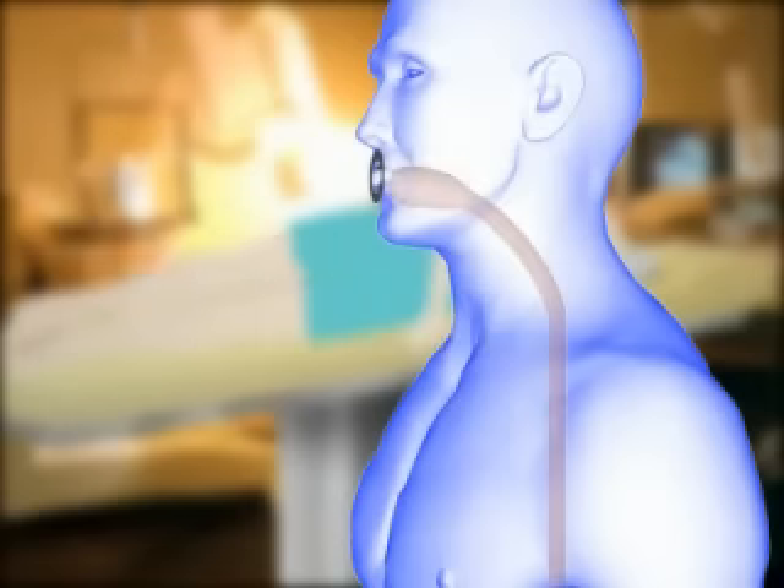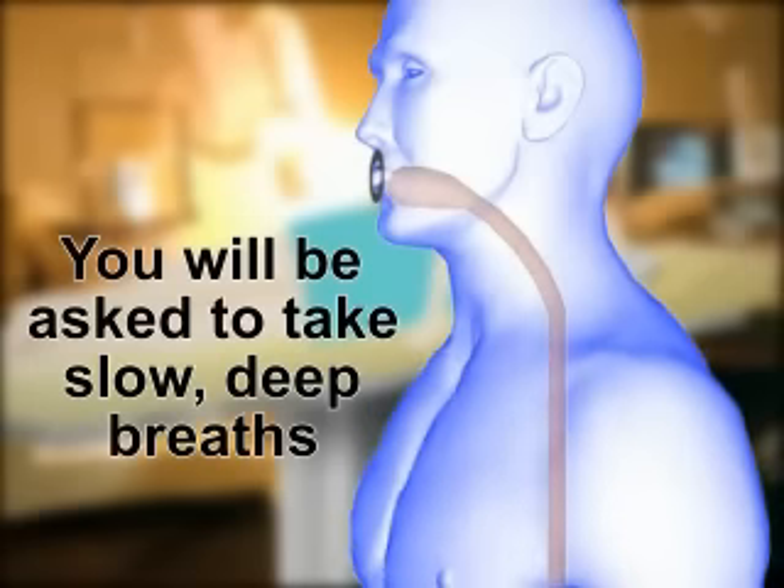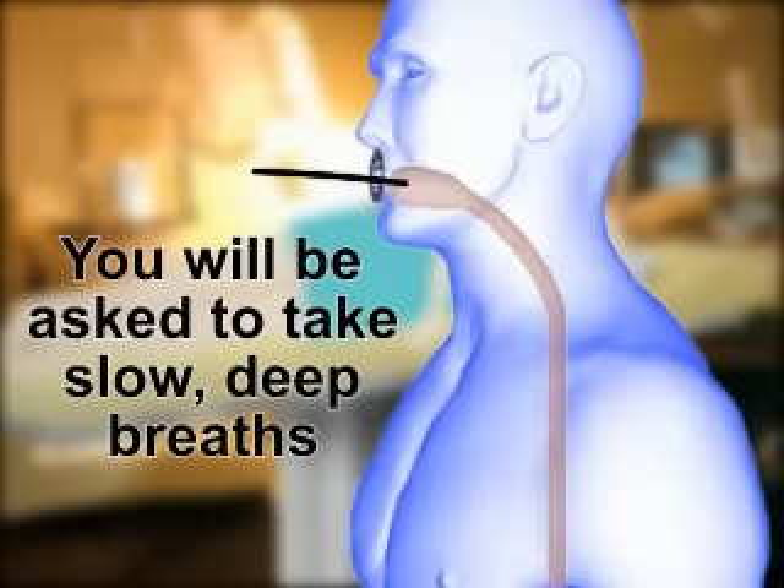In order to help relax the muscles in the back of your throat and help open up the passageway, you will need to take slow, deep breaths. You will then be instructed to put your chin to your chest and open your mouth. As the doctor begins to push the tube in, you will be asked to swallow. Swallowing makes the tube go down more easily.